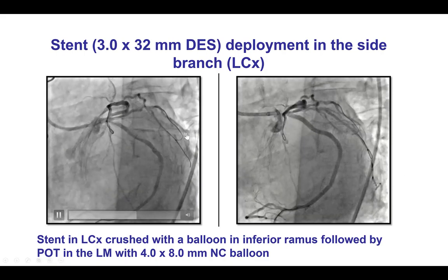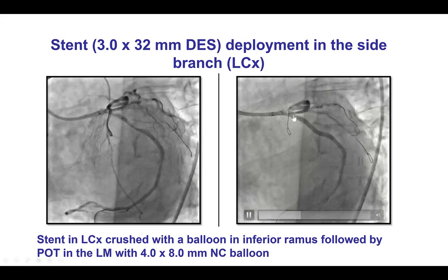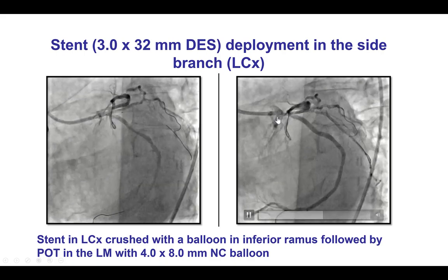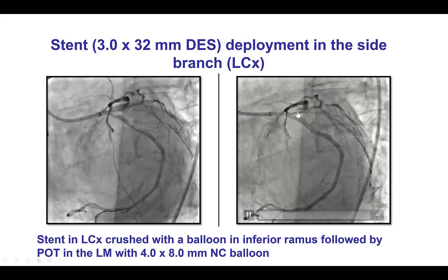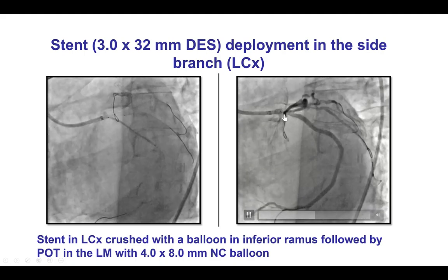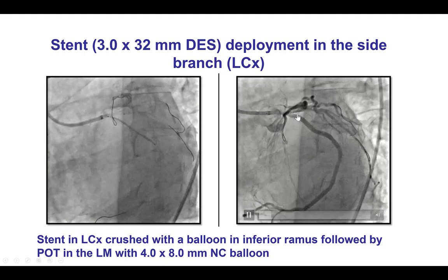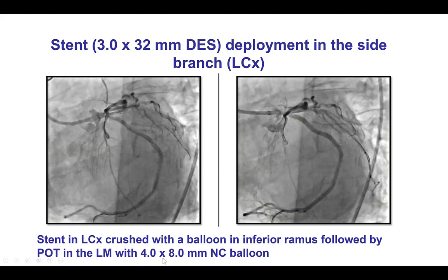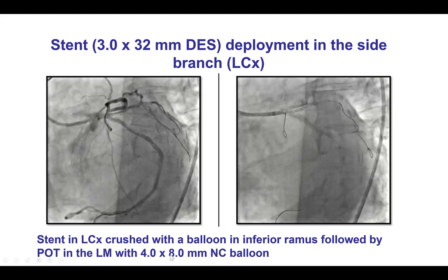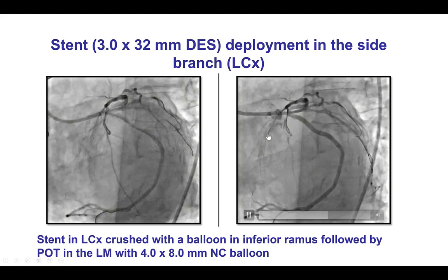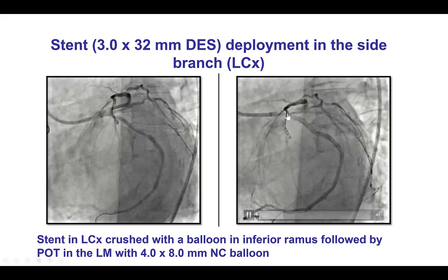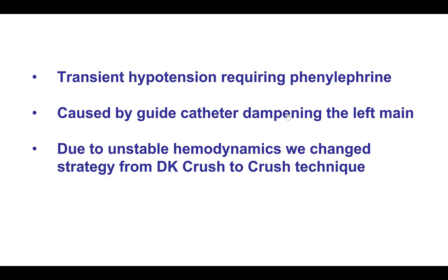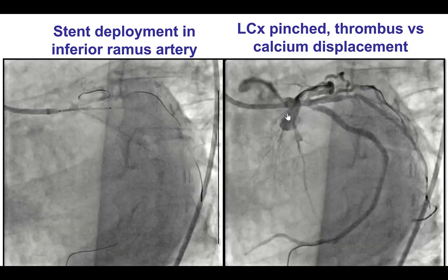We started by dilating all heavily calcified lesions using high-pressure balloons. There was a waist in the inferior Ramus that eventually resolved with higher-pressure balloon inflations, although there was some compromise of flow to the inferior Ramus. We then treated the mid-circumflex and mid-LAD lesions before treating the bifurcation. We took a long drug-eluting stent from the mid-circumflex all the way to the left main. This was deployed and crushed using a balloon placed in the inferior Ramus, followed by a proximal optimization technique with a 4.0 by 8 mm non-compliant balloon. This went well; however, the patient did develop hypotension at this point, and we decided to change our strategy.